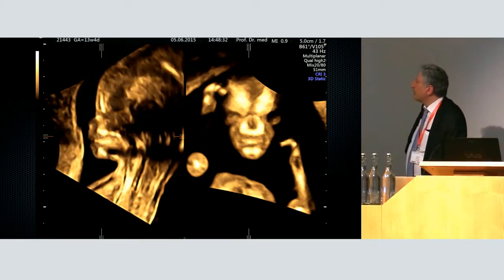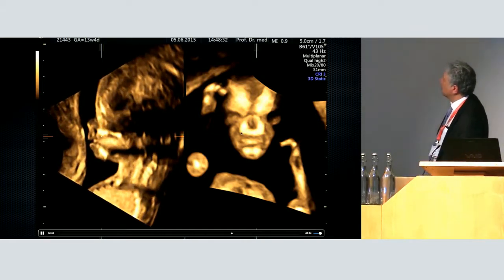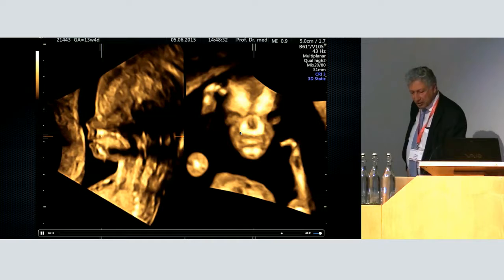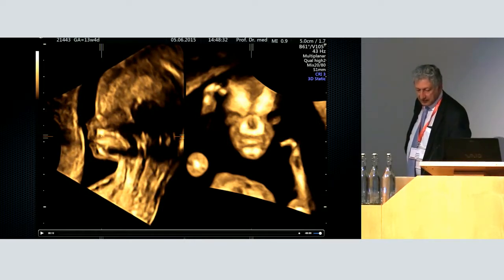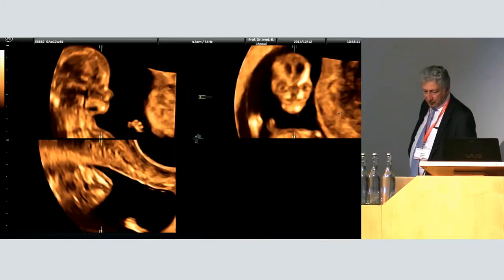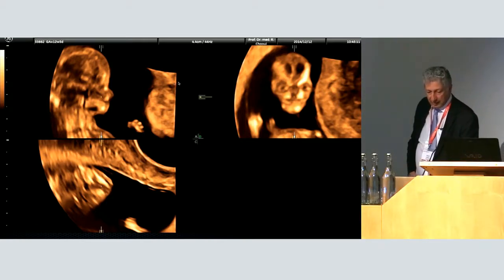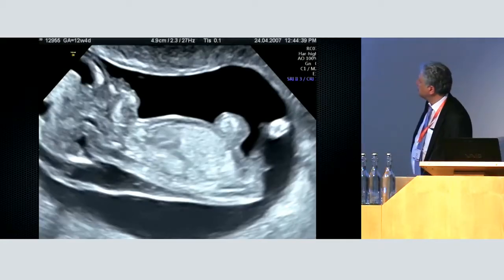I take a volume and I learn on a volume to move from left to right, from the processus maxillaris across the maxilla to say what is the potential of which plane. And you see here in the next image, you have a maxilla, but you have an absence here. If you look at this plane, you see exactly the scheme I was showing you. Because I put the line here, we have anterior part, but a gap here, and this is the gap seen between the cases. So this is the volume of a cleft at 12 weeks plus 5.